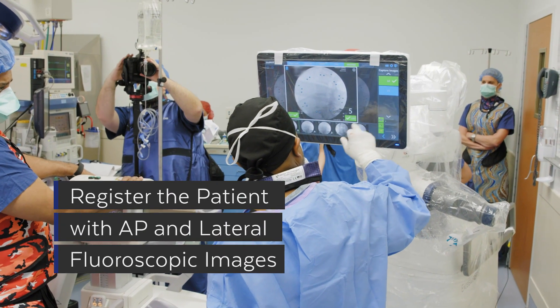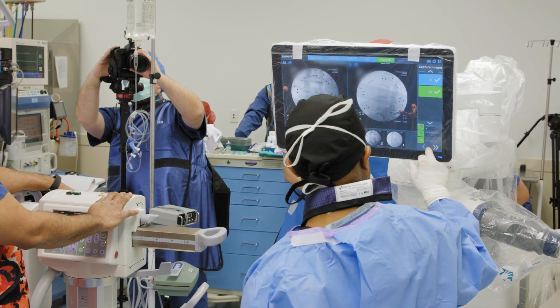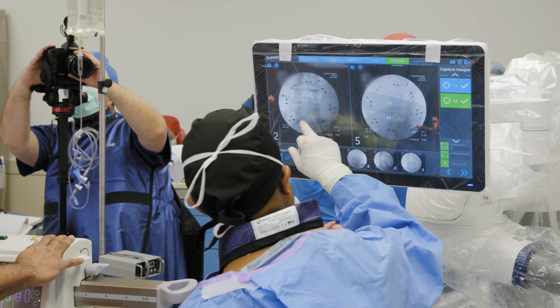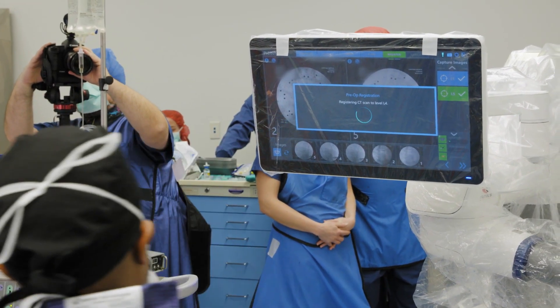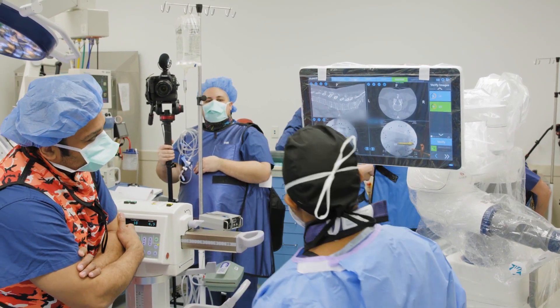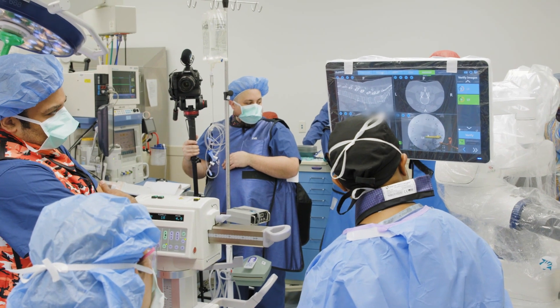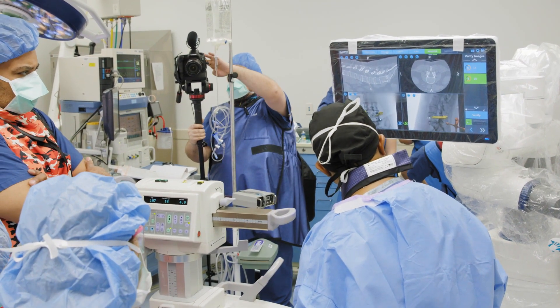Here you can see us getting our AP and lateral for both L4 and L5. You can do this as the surgeon because it's draped sterile, or you can have your robot representative do this on the iPad. We're registering — basically merging our intraoperative fluoro shots with the pre-operative CT scan to see how accurate our merge is. You just want to make sure the end plates at L5 are matching up between the pre-operative CT and intraoperative fluoroscopy.